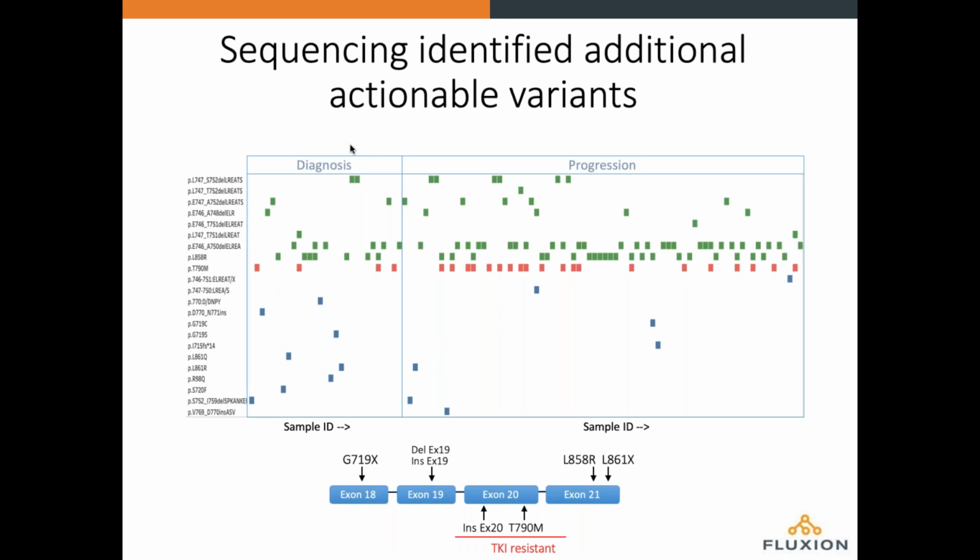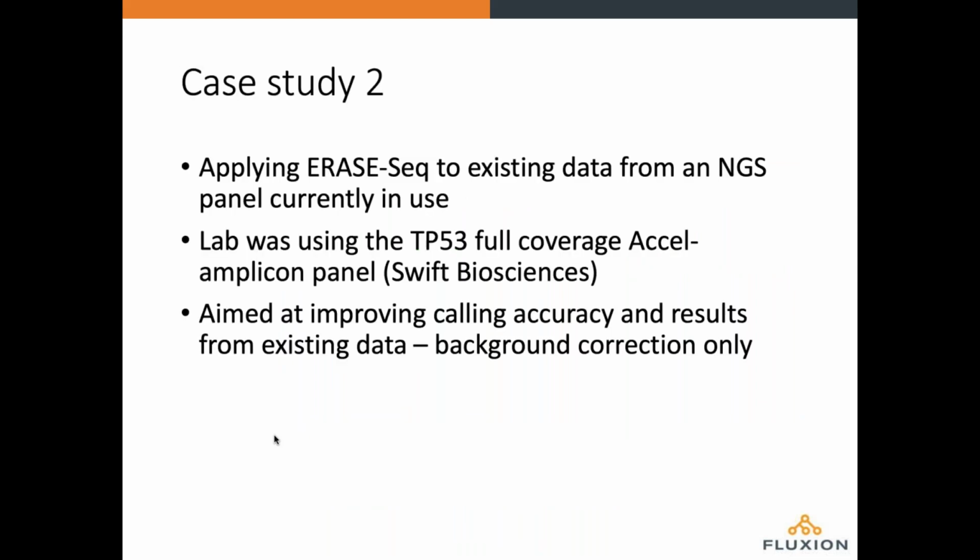This is very exciting work that's being reviewed now as a publication, and I won't go too deep into it, but you can also draw a lot of conclusions about cancer progression, because there are 2 different cohorts. There's a cohort that's being tested at diagnosis, and there's a cohort that's being tested at progression. Anyway, it's a very nice data set.